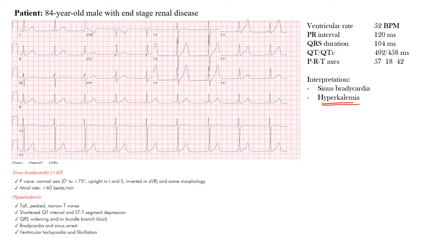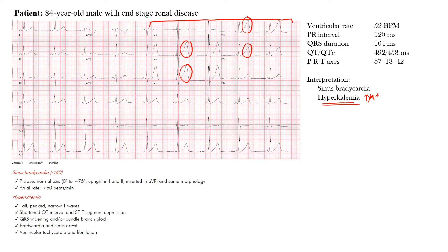The severity of hyperkalemia is actually correlated with the EKG changes and the risk for arrhythmia. Hyperkalemia means we have an elevated serum potassium. The main finding we're noting here are these very peaked T waves. The first sign of even mild hyperkalemia are these pointed T waves — they are the earliest sign, tall and narrow, and most prominent in the precordial leads V1 through V6.